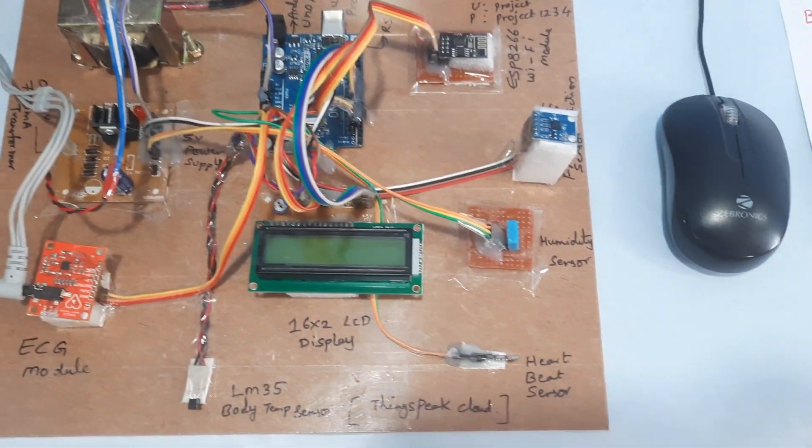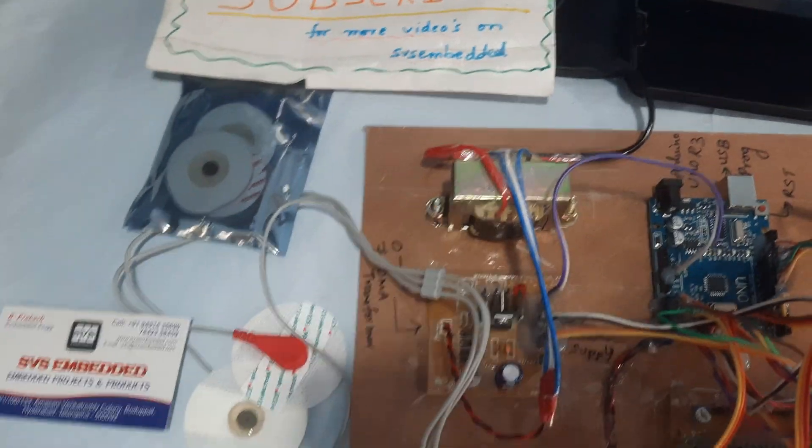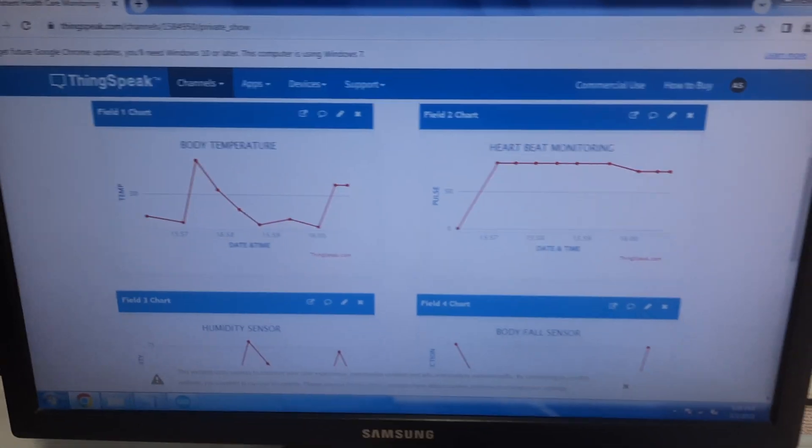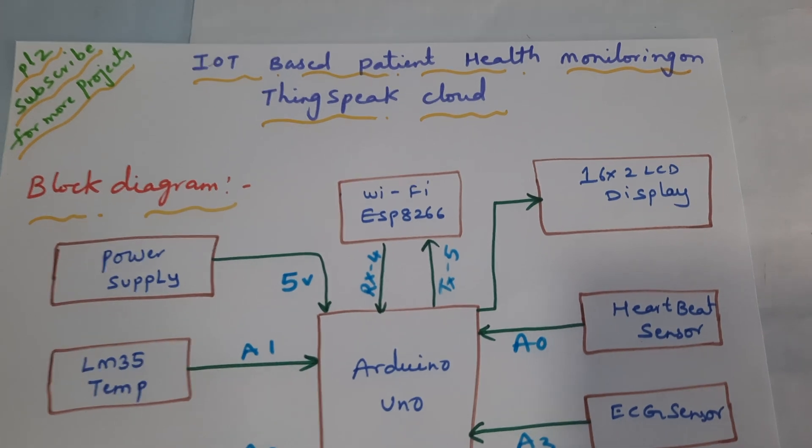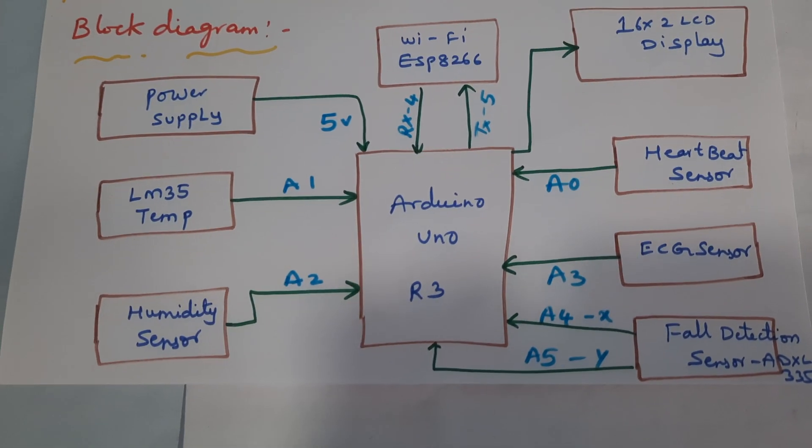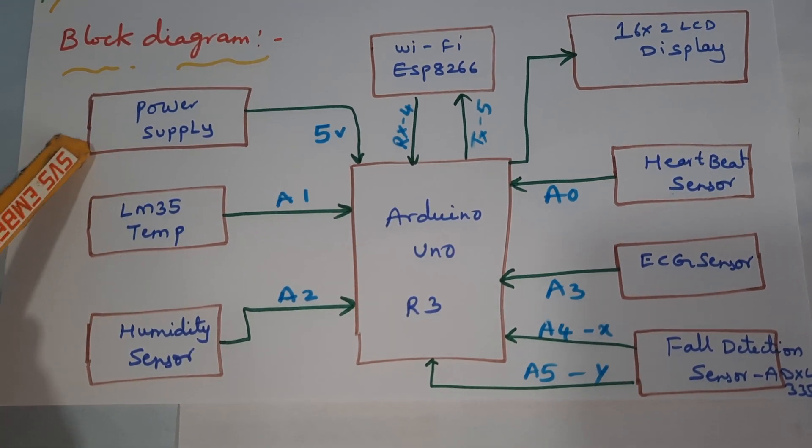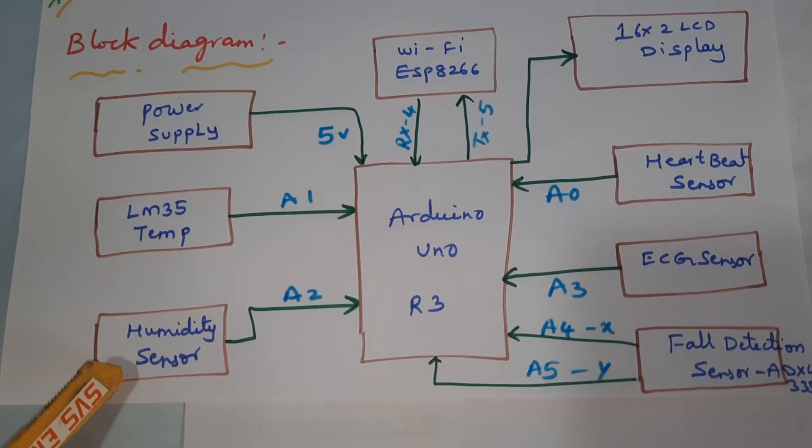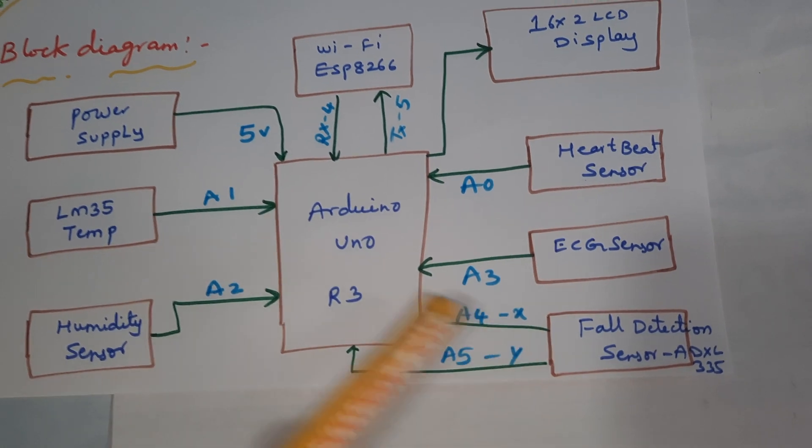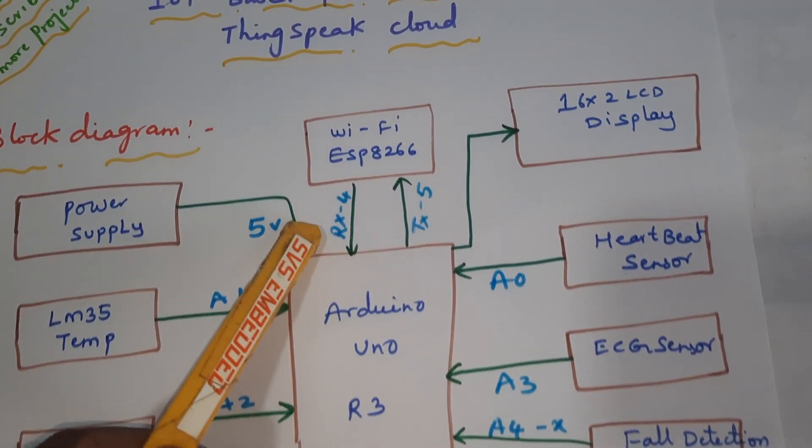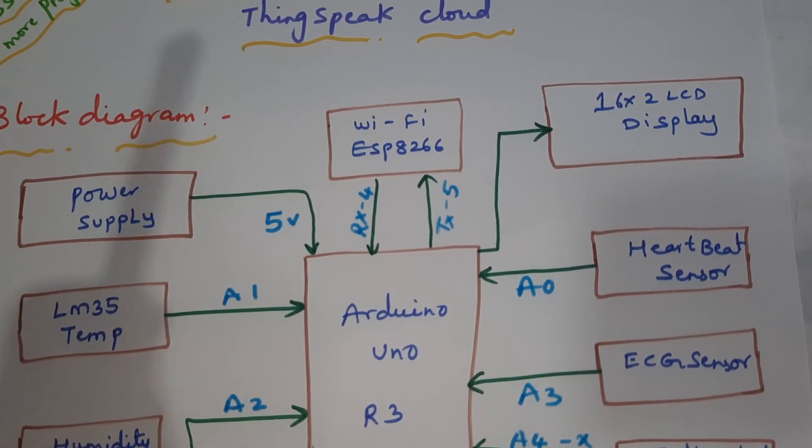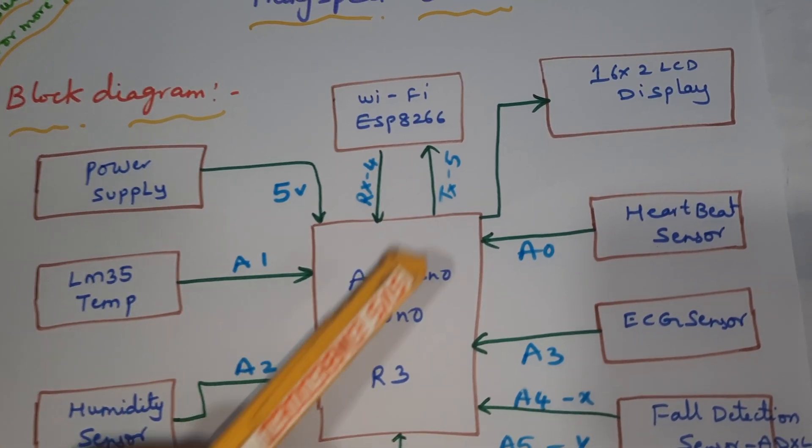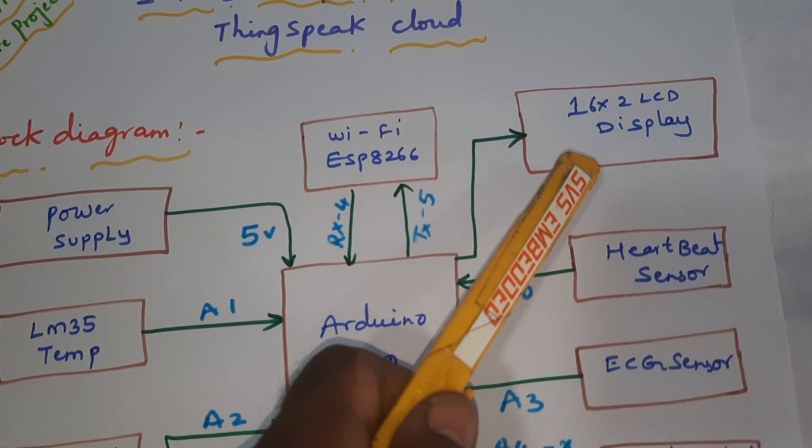Hi, we are from SVS Embedded. The project title is IoT-based patient health monitoring on ThingSpeak cloud. In this project, we are using an Arduino Uno R3 board, LM35 temperature sensor, humidity sensor, heartbeat sensor, ECG sensor, and fall detection sensor. We are using a total of five sensors with an ESP8266 Wi-Fi module, and it is sending the data to the ThingSpeak cloud server. We are monitoring the data on a 16x2 LCD display.